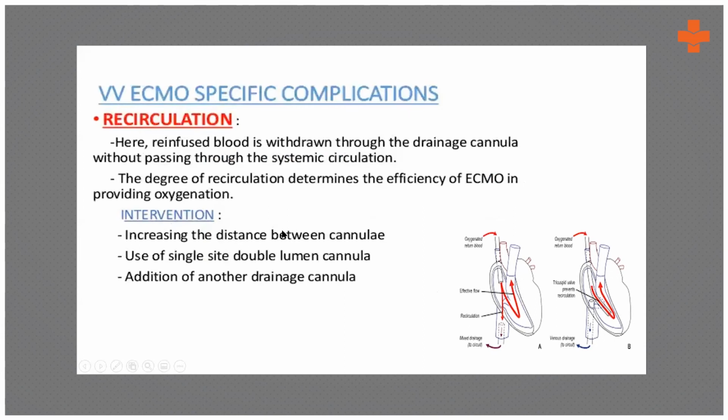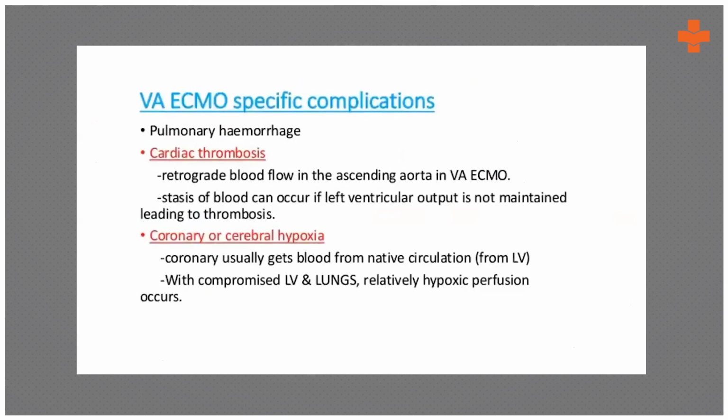So what you can do is increase the distance between these two cannulas, or you can position them in such a way that this blood flows directly to the heart and out of it. Thrombosis, like I told you, is a very common complication.